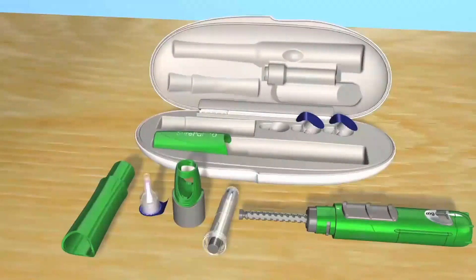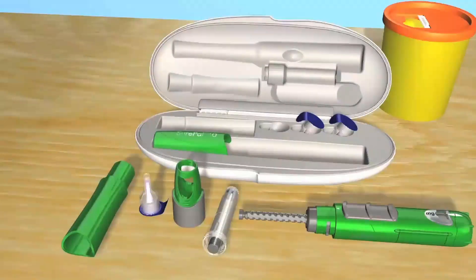To review, we have the hard case, the pen cap, the needle hider, a needle, the locking ring, a preassembled cartridge, and the SurePal body. And don't forget you'll need a sharps box for your used needles and disinfectant swabs for cleaning the cartridge.